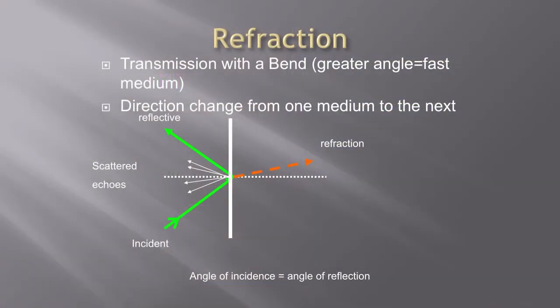All right, so reflection. Refraction is going to be the next one, and this is basically the bending of the sound wave. It all depends on the tissue that it's going through. You look at this, and it looks like a physics image. So I'm just going to move on so I don't freak you out.